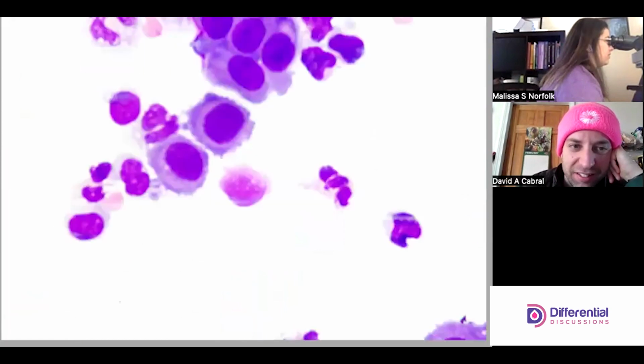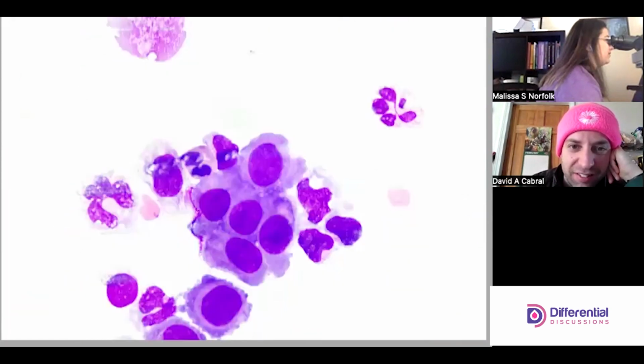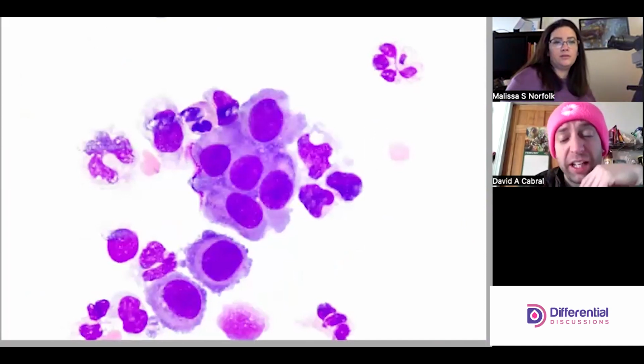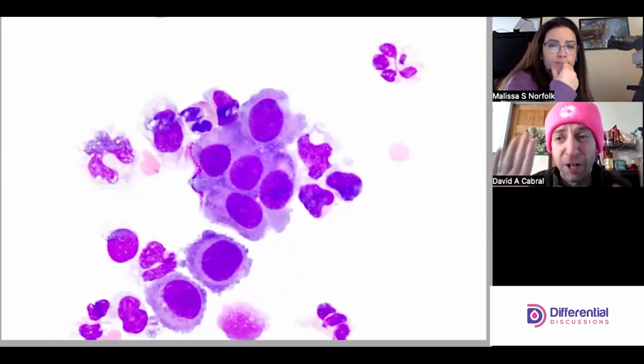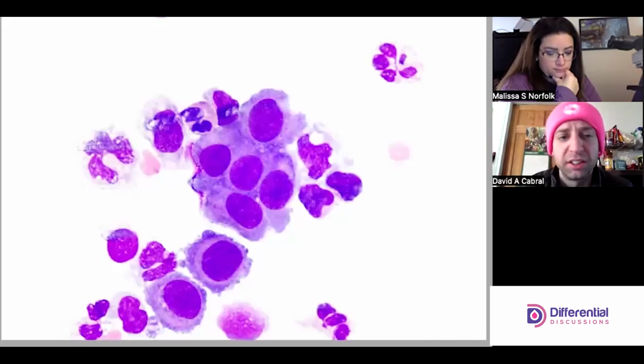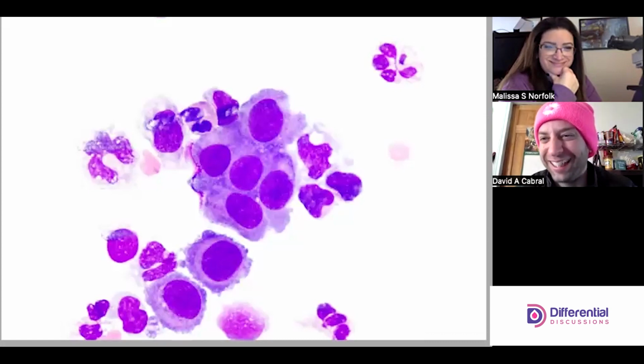Oh, there's a couple more over here like this. This has really, really good mesos. So we saw a couple of concerning splotches on video, but for the most part, this is a pretty normal sort of serous fluid. I think you said is it ascites? Yeah. I'd say this is very consistent with some kind of garden variety effusion, as far as what one would get in an effusion.